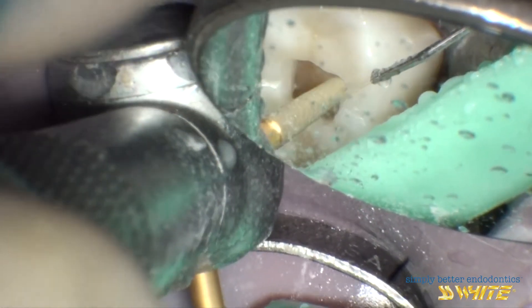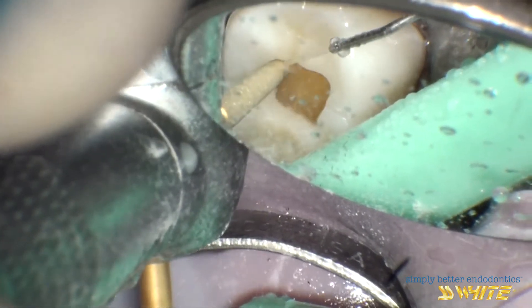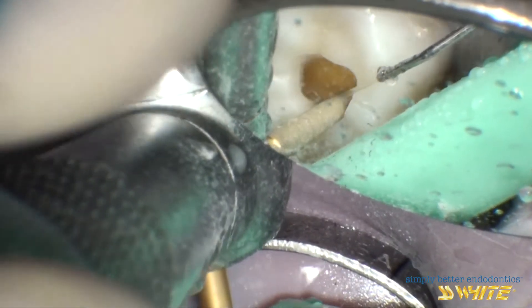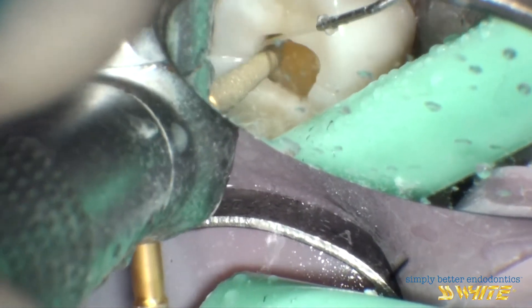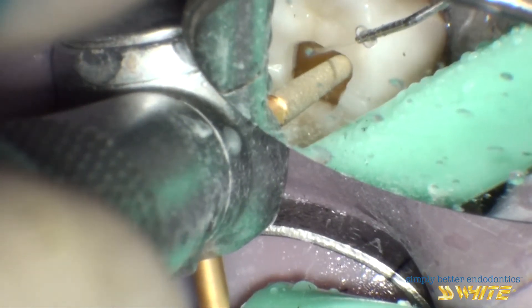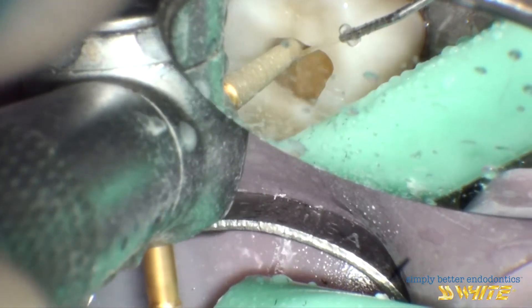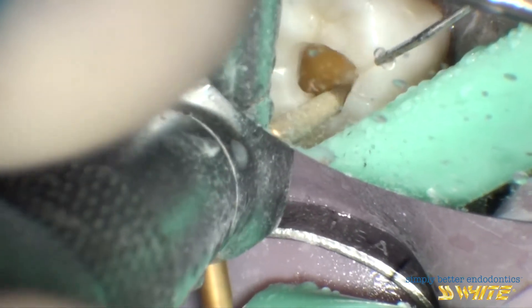This first stage is done using the 856 tapered diamond just into the dentin. Notice how efficiently the instrument cuts the metal and zirconium.